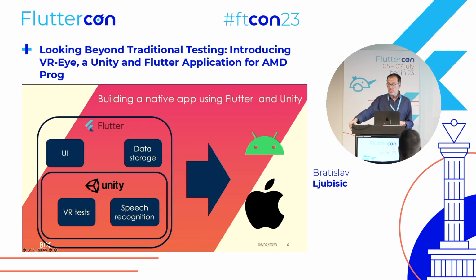The main job of Flutter is the UI for the patient, the initial UI where the patient selects the test they want to run, and also the data storage and classification of results coming from Unity. For speech recognition inside Unity, there is only one library that we could use.